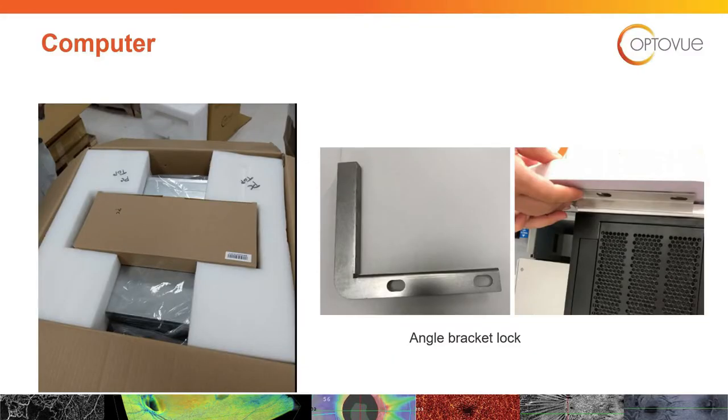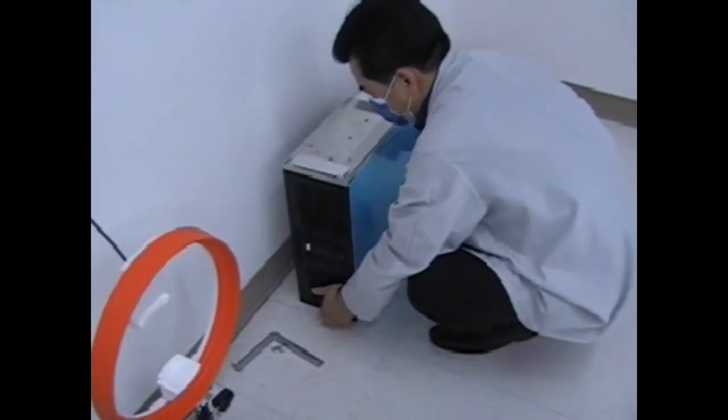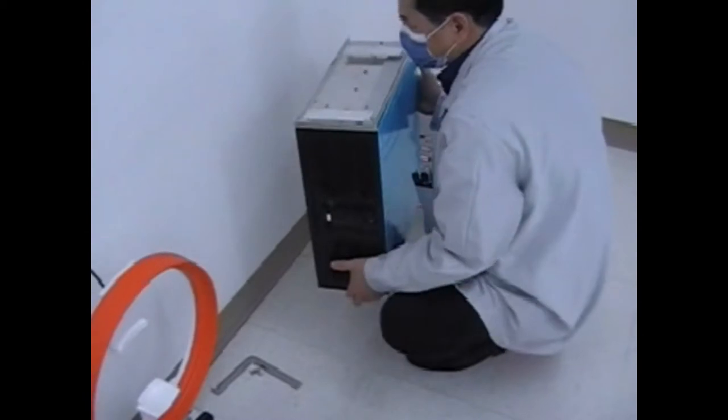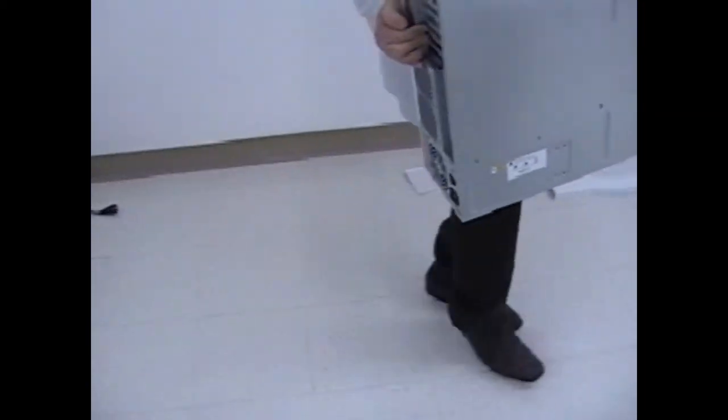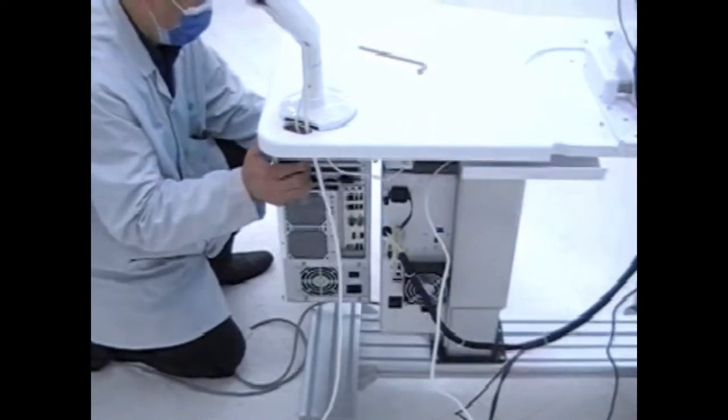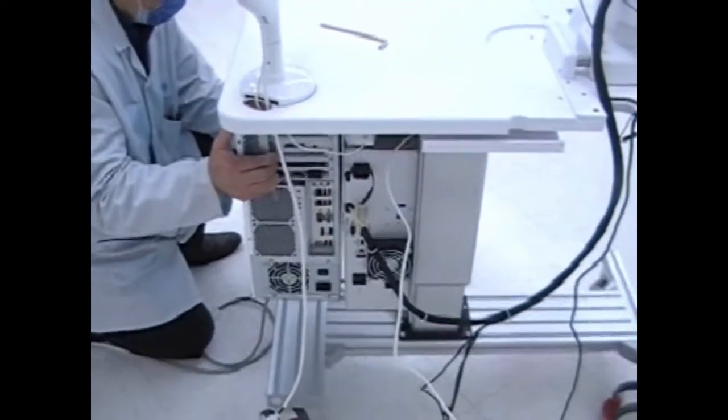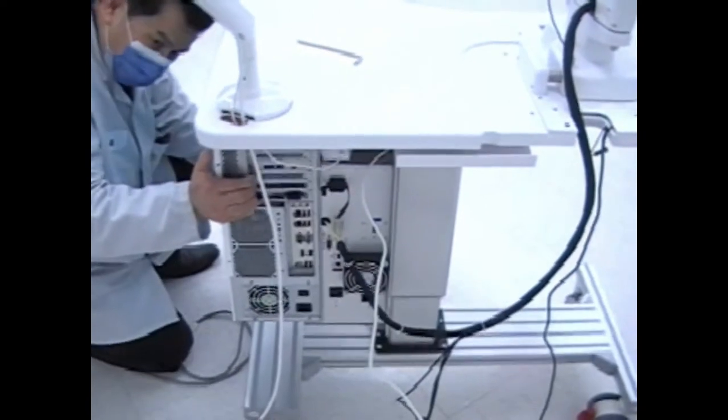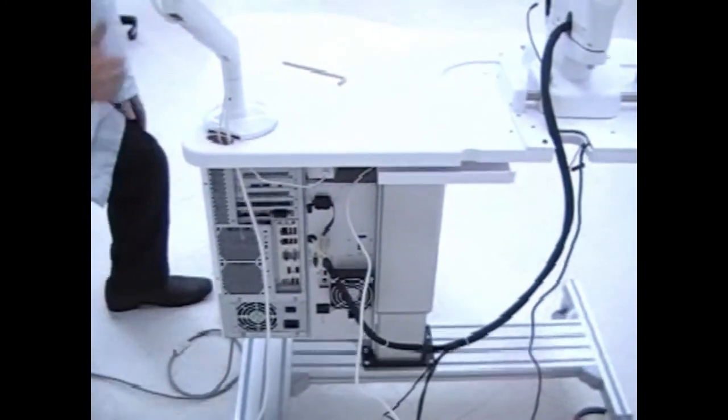Next we want to hang the computer on the hooks down below and add the locking bracket. Lift carefully, the computer is heavy. Make sure the table is at a good working height. Lift it up evenly and slide it onto the hooks.